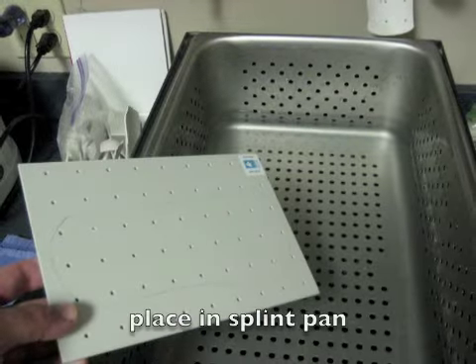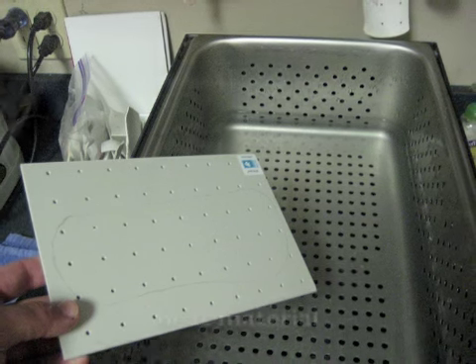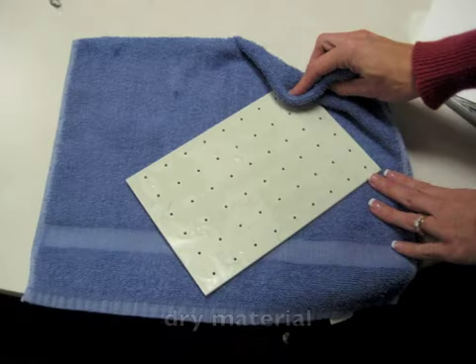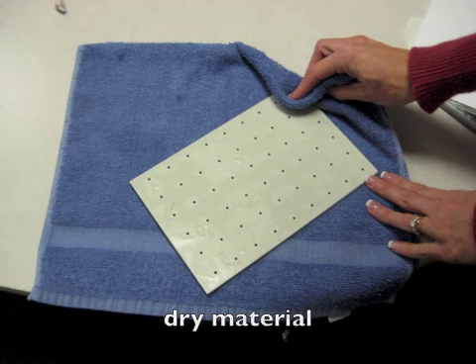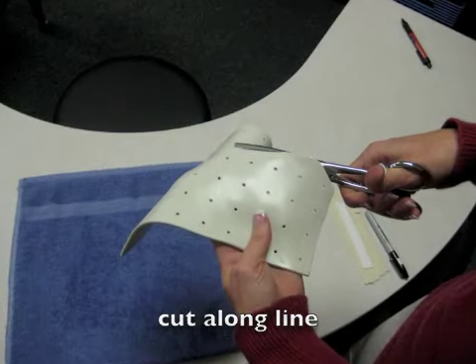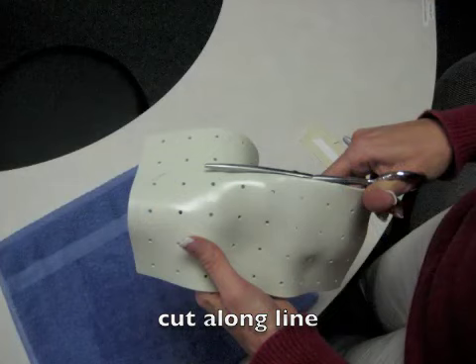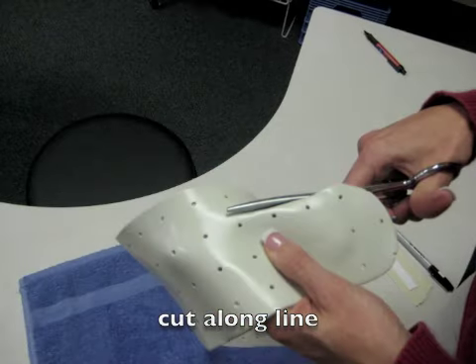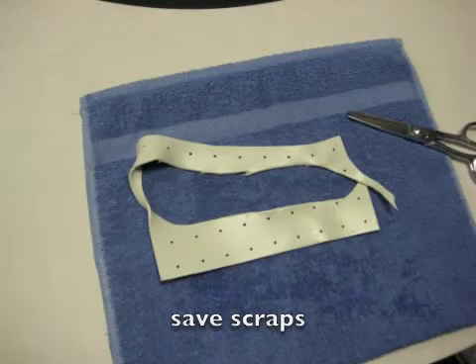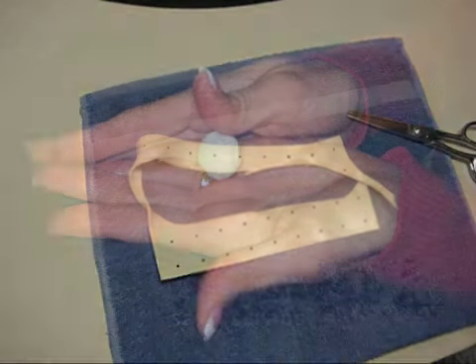Place the material in the splint pan to heat up and soften so that it can be molded. To check the softness of the material, use your spatula to lift the corner of it while it's still in the water. Once the material is soft, remove it from the water and dry it. Next, cut along the line on the material that you have traced from your pattern. Scraps can be used to make other small splints or to make materials for range of motion exercises in the clinic.